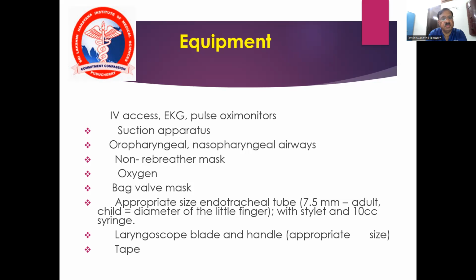For carrying out the procedure of endotracheal intubation, there should be a working suction apparatus, because invariably orotracheal secretions will cause partial obstruction, and even they will act as a hindrance for endotracheal intubation, and even aspiration or regurgitation of these into the lungs will lead to lung injury.